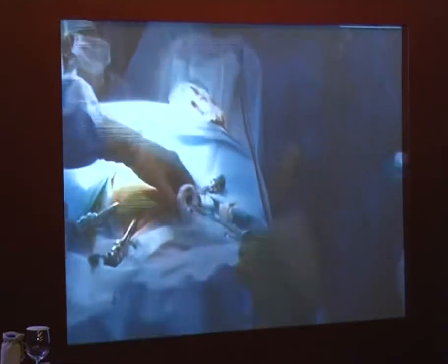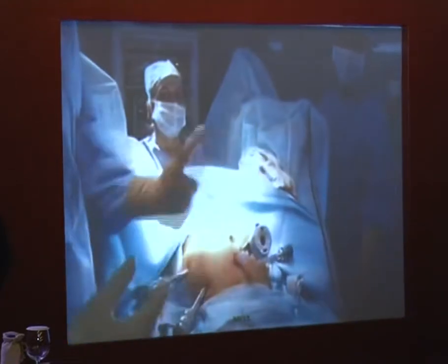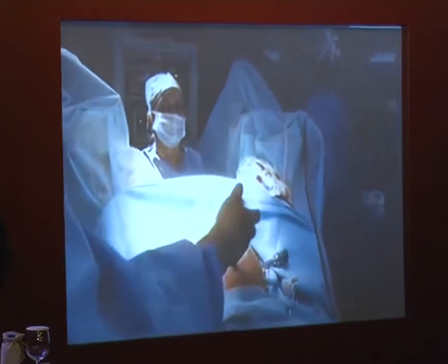We're going to have to start off roughly the same way we did with the first two cases. She's petite, so I kiss the corner at 45 degrees like we did before, right here. I think that'll work.